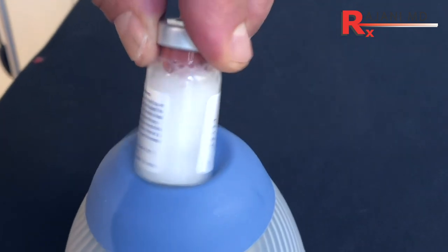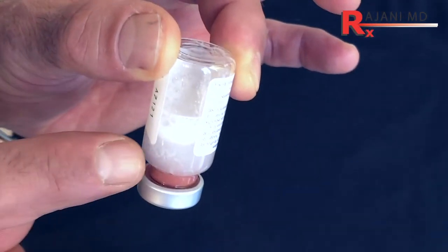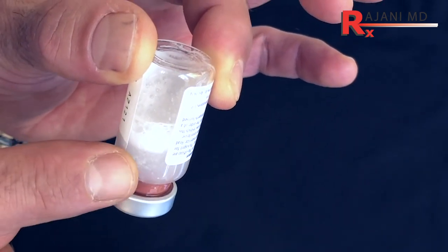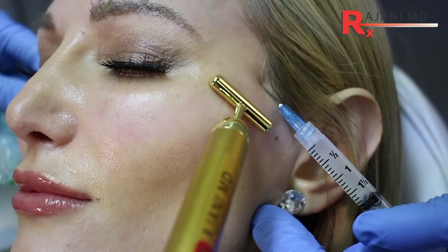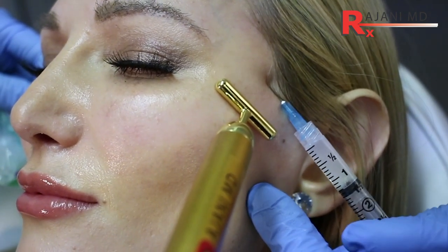To get a nice uniform PLLA blend, draw up from the middle of the vial. Invert the vial for about 20 to 30 seconds prior to taking the product out — all the carboxymethyl cellulose, which is mainly the clogging factor, goes to the top. Then draw the product out from the middle of the vial and place it in the syringe, avoiding the product sitting at the top, because those are the clogging factors. This will greatly reduce clogging.